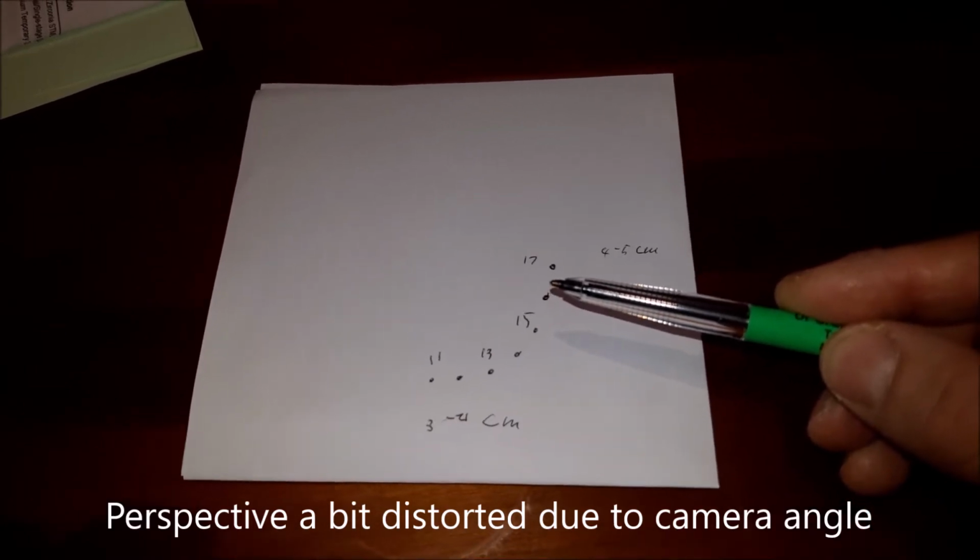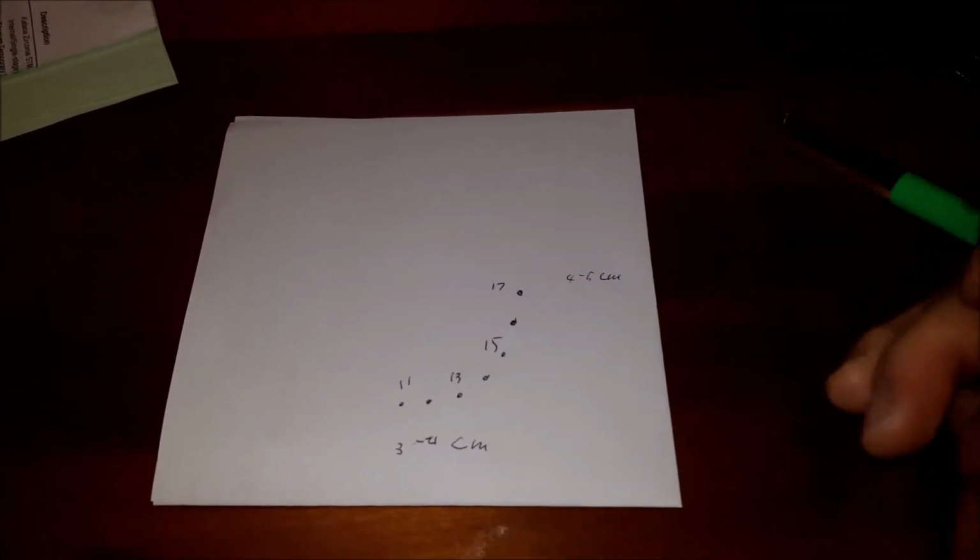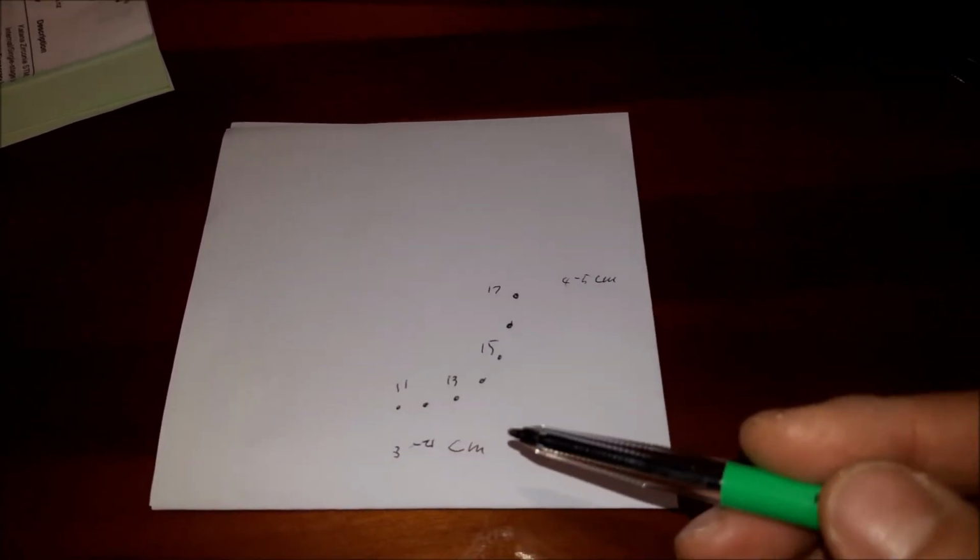And the arch, you are welcome to think back of that stamp we used to use back in uni where they placed a stamp on it. This looks broadly similar to that stamp.